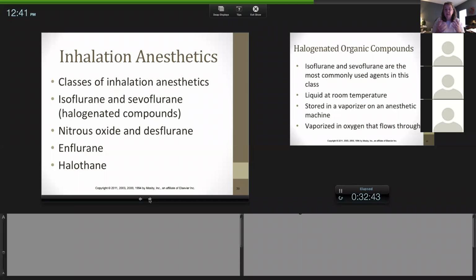So all I'm saying is when you squeeze these little lungs on a cat, you don't want to overexpand or hold pressure in there too long because, first of all, you don't want to damage the lungs. Secondly, you don't want to compromise blood flow. Those are two consequences. I always talk about the benefits of bagging. What are the downsides to ventilation? Whenever we do positive pressure ventilation, you are changing thoracic pressure, affecting blood flow. Something to think about.